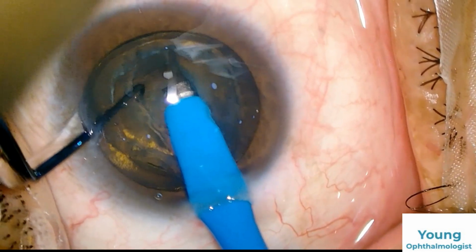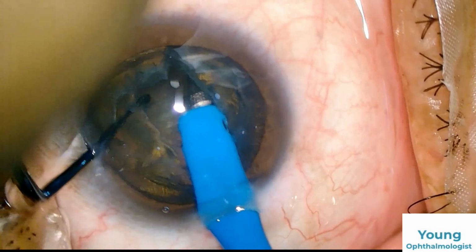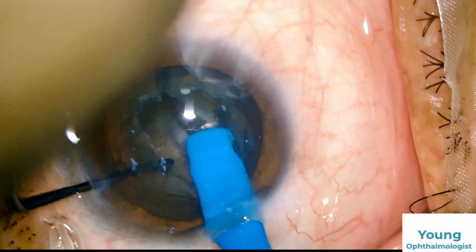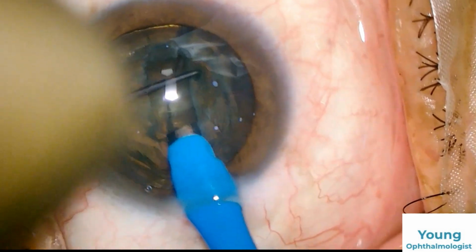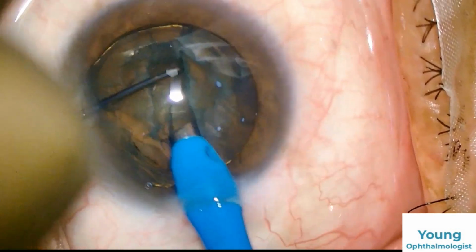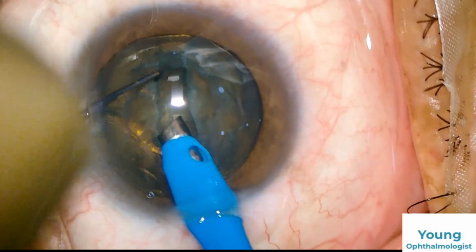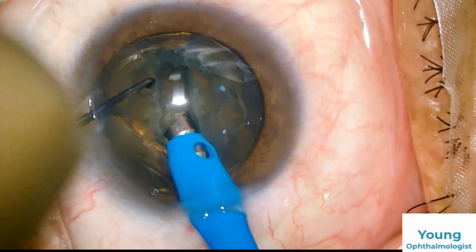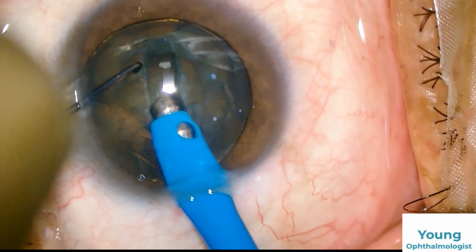It's very important when you are doing topical phaco, you should plan your surgery each and every step in your mind to minimize the surgical time so that the patient is cooperative during the whole surgery. For the fluidics and phaco settings, you can use a little bit lower bottle height. Normally we use 100 centimeter, you can use like 80.